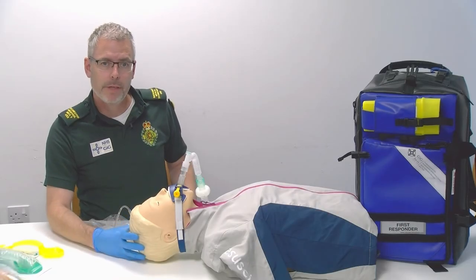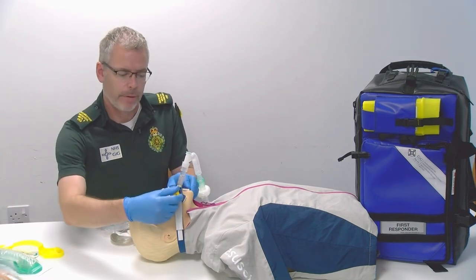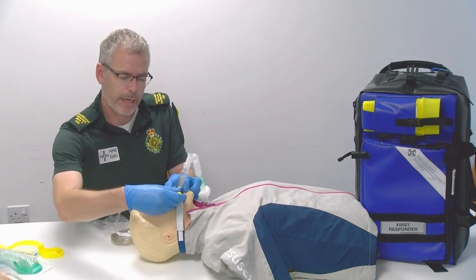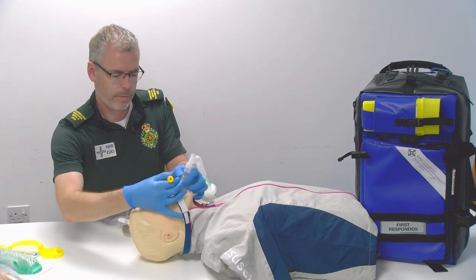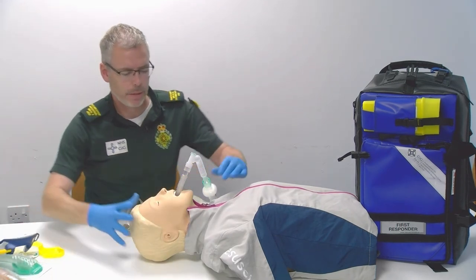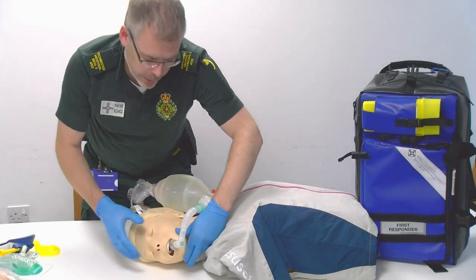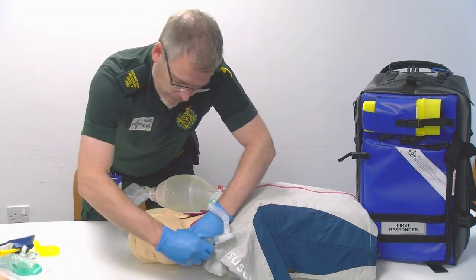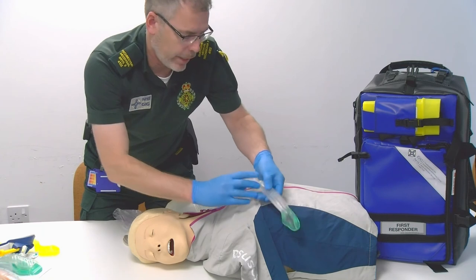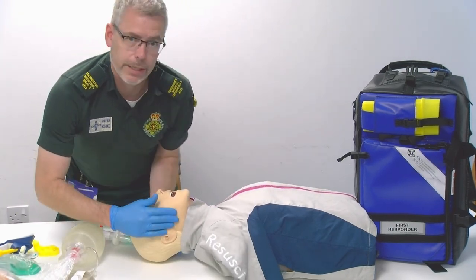If the patient has a return of spontaneous circulation and starts to gag on the iGel, the action then is to remove the clamp, put the clamp to one side, turn the patient's head to the side and encourage the patient to cough. If they're able to cough, as they cough pull the iGel out; if not, pull the iGel away and reassess the airway.